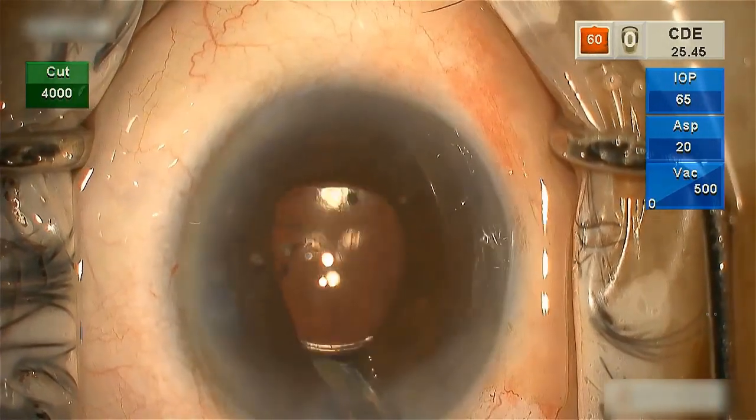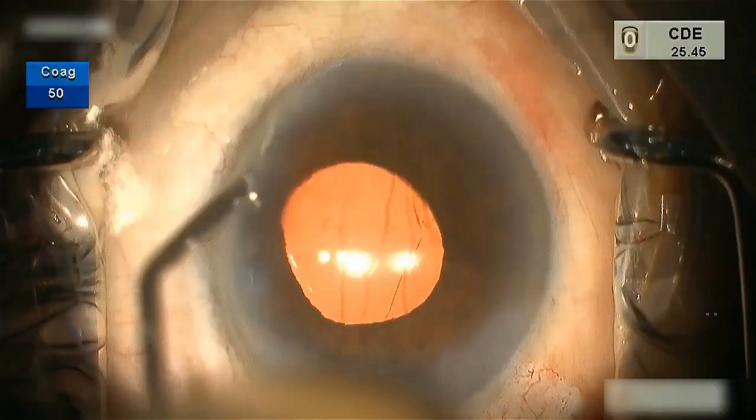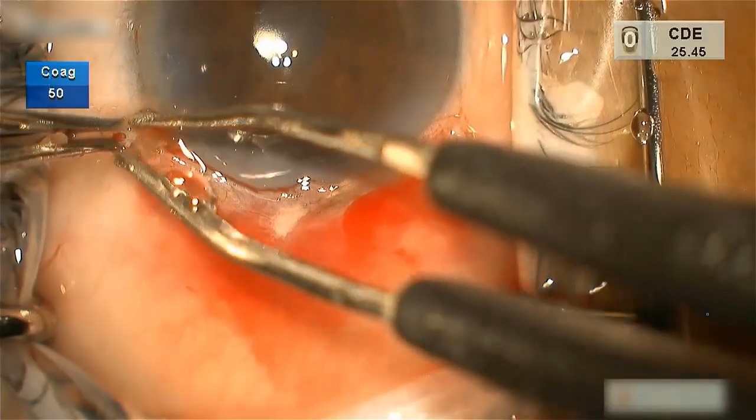If vitreous strands are found in the anterior chamber, automated anterior vitrectomy has to be performed. Stromal hydration is done to seal the wound. If necessary, a suture can be applied.